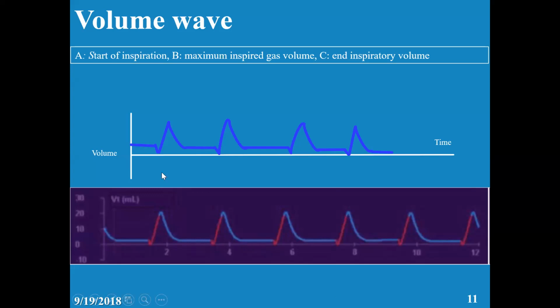And you said it's PSV. Why is it PSV? Because in PSV only there's assisted waves. Yeah, it can be assisted. It can be AC. It can be PSV. Both. But we cannot differentiate based on this volume only whether it's PSV or AC, because I will show you later. So you can see A, B, C, and D.